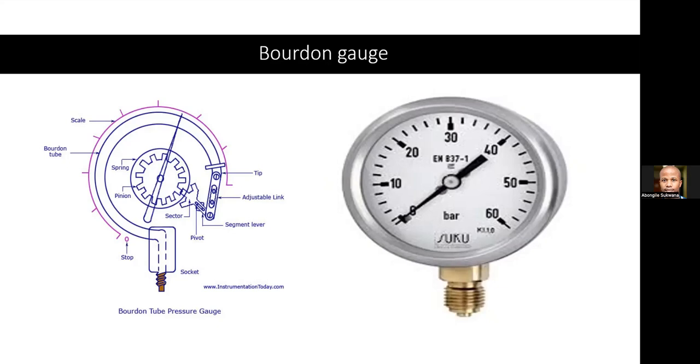So that's why she's saying the pressure will be constant at a certain number until the liquid form runs out, and then you only have the gaseous form. Then it will start moving as you finish that one. The best way to monitor it is with the pressures and also weighing the nitrous oxide cylinder. I hope that makes sense. Otherwise, well done. I'm really happy.